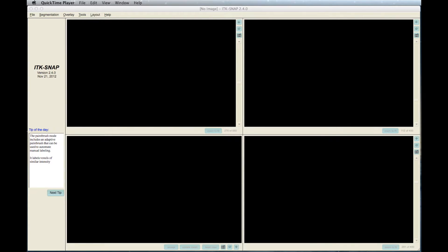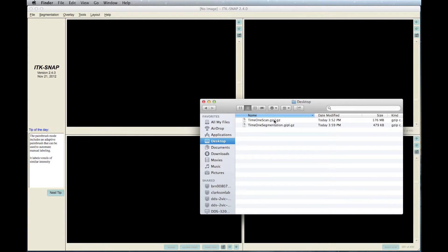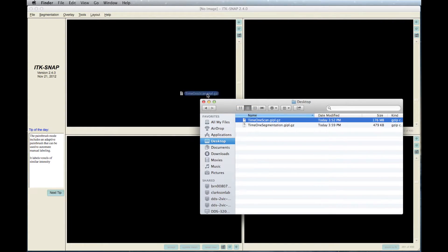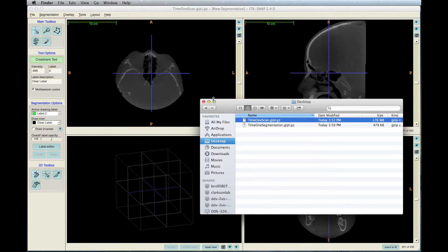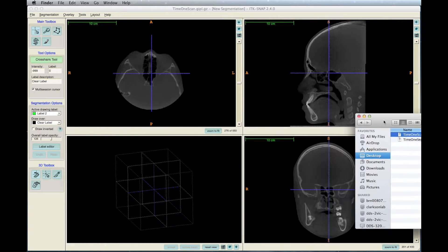First, load the scan into ITK-SNAP. It can easily be done by dragging and dropping the scan into ITK-SNAP's window.